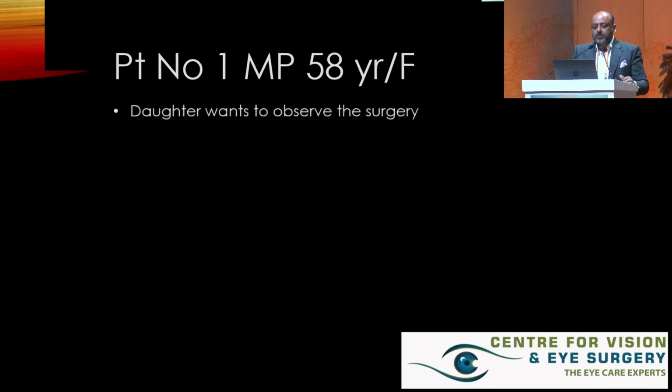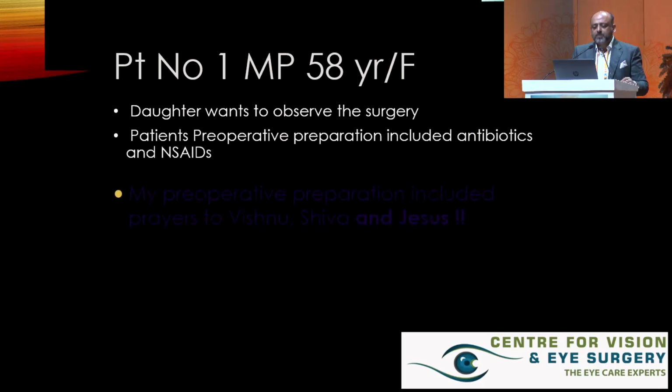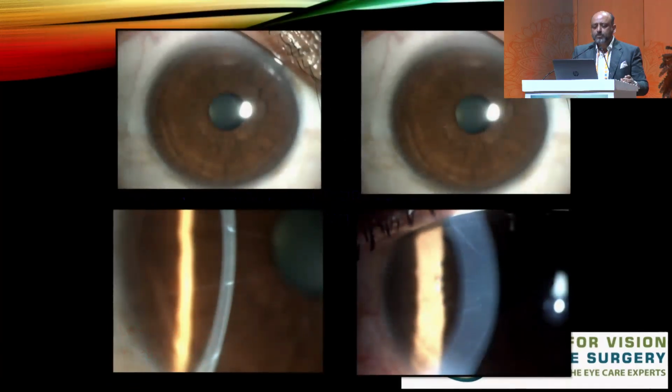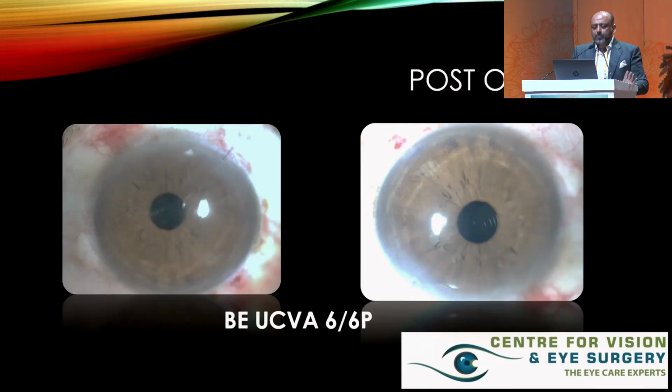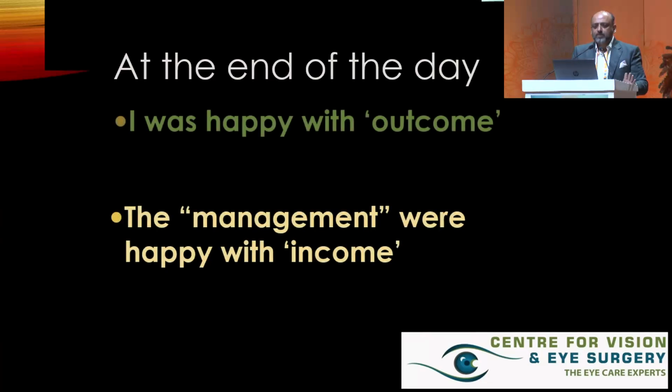The daughter wants to observe surgery, and she does come in for surgery. The patient's pre-op preparation included antibiotics and NSAIDs, and my pre-operative preparation included prayers to Vishnu, Shiva, and Jesus. And luckily for them and me, the surgery went off perfectly. Post-operatively, in a post-RK patient, we were lucky with good vision after surgery with trifocals. At the end of the day, the management was happy with the income, and I was happy with the outcome.